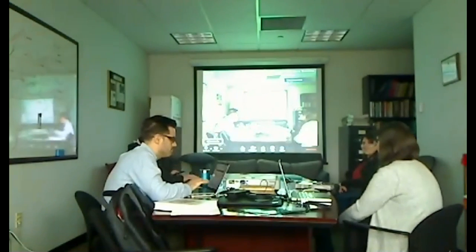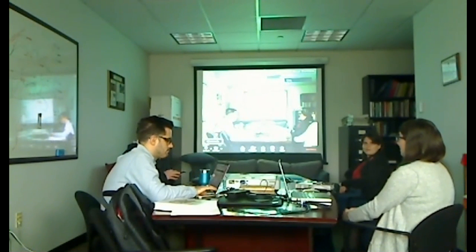And I thought I had a lead here. And I may have it as soon as I'm looking it up on my phone. Well, maybe this is not of the utmost importance now, so maybe we can put this off to a later time or another conversation. Sure, no problem. It's a good point. If there is nothing in there, this is functionality that would be useful to have, so I'll put it into my queue of stuff to add, and I'll create a function similar to the one that we have for creating spherical ROIs within the MNI space, or at least have the option to do that in FS average space as well.